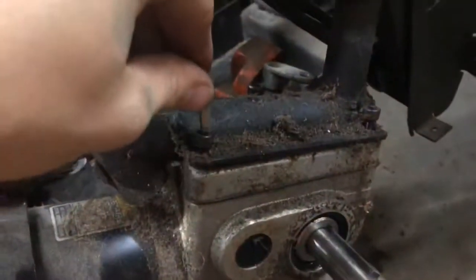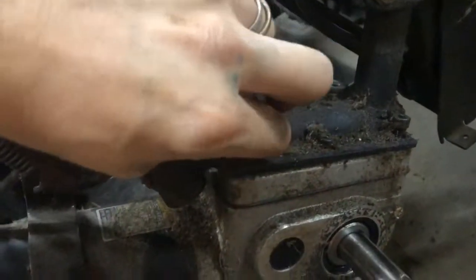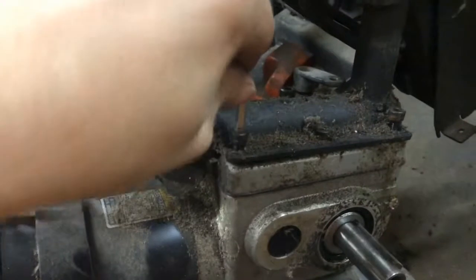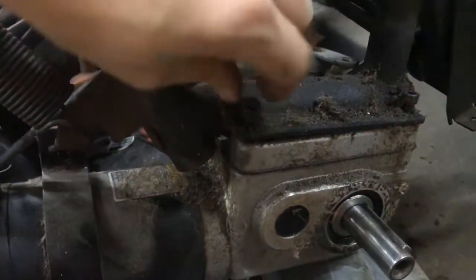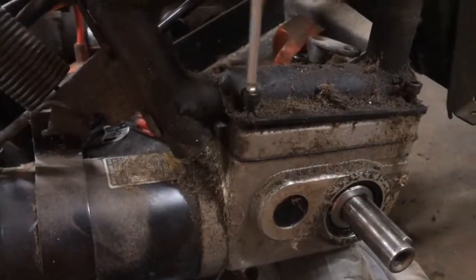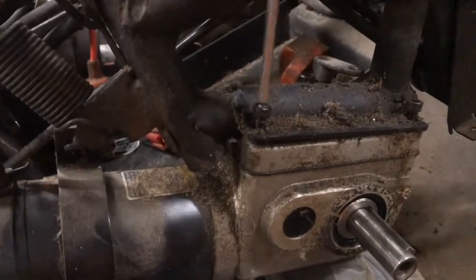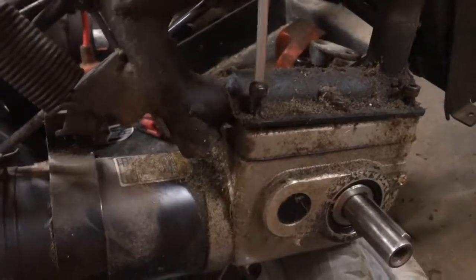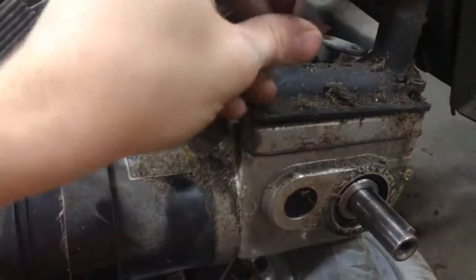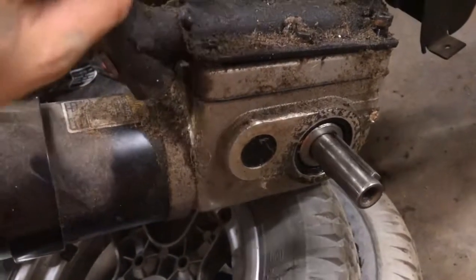Let me see. Eventually I'll be able to turn it by hand. It's not right now. Go ahead and get this back one out.